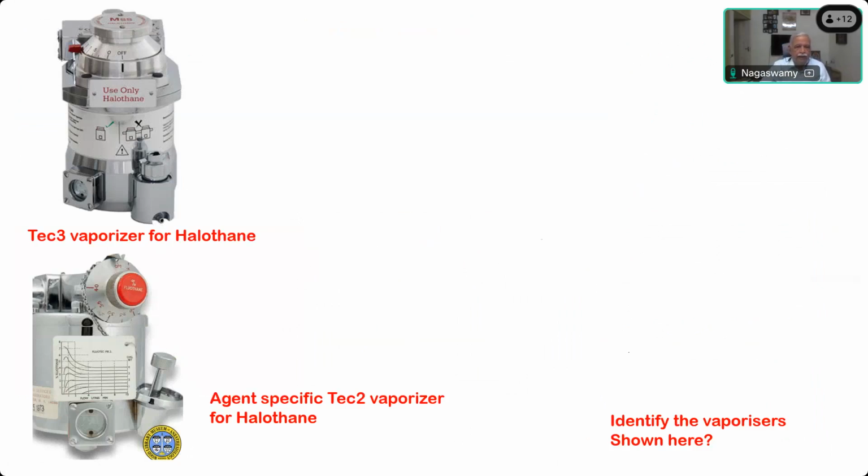To drain that, the top hole will be used to unscrew a nut underneath this assembly. This is the assembly, and you will have a small nut underneath that. You remove the cap and then fix it onto that, and then you can drain the whole thing, holding the bottle over here, and again fill it up the next morning when you start the list. So that is the reason for that.